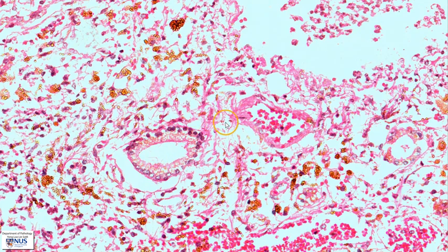Patients with hemochromatosis are at risk of not only cirrhosis but also hepatocellular carcinoma.